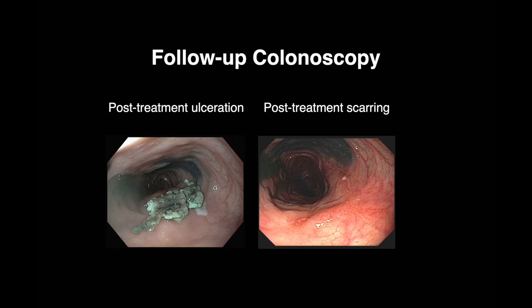There were no procedure-related adverse events. Repeat endoscopy was performed prior to necropsy and showed ulceration, 9 out of 10, and scarring, 1 out of 10, at treatment sites.